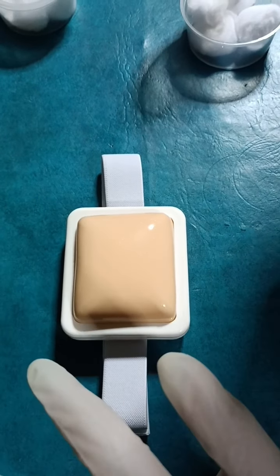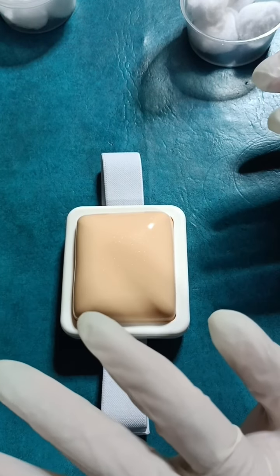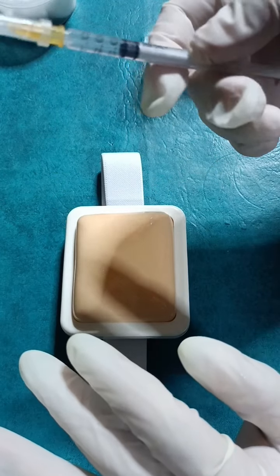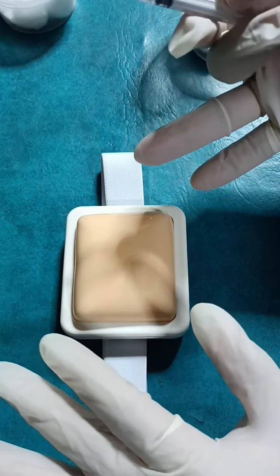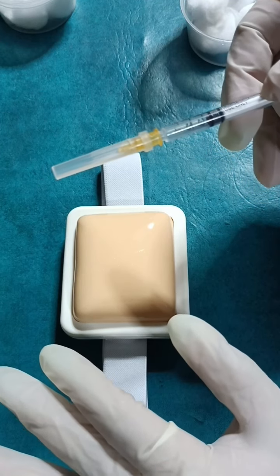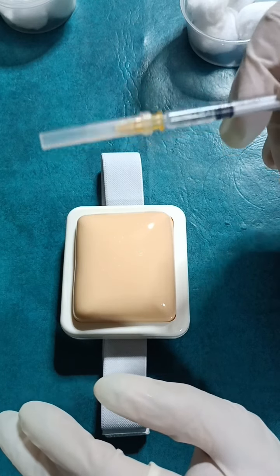Next is to prepare the syringe for injection. Remove the needle cap while waiting for the antiseptic to dry. Pull the cap straight off to avoid contaminating the needle by the outside edge of the cap.